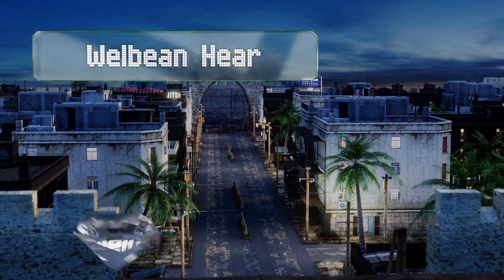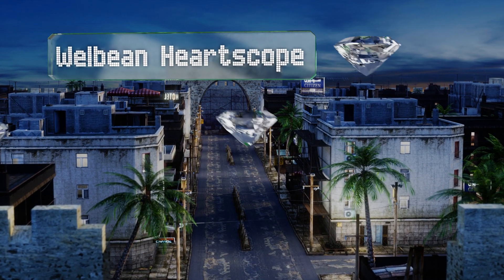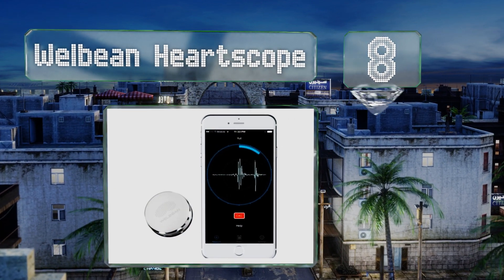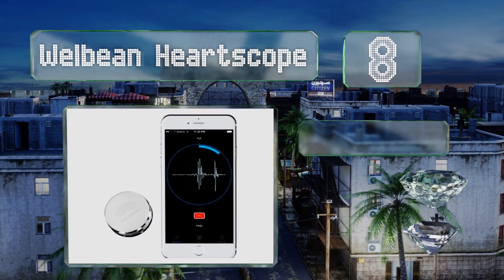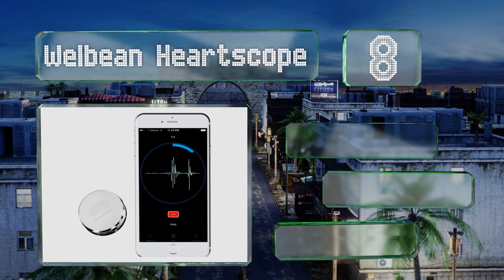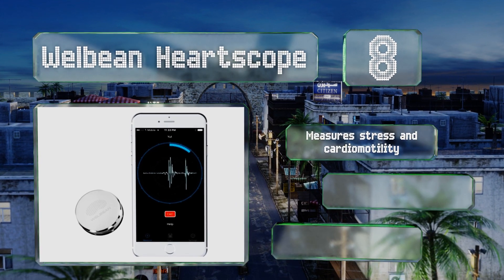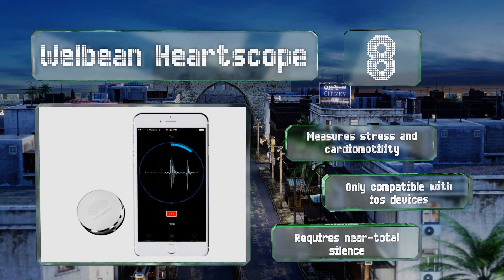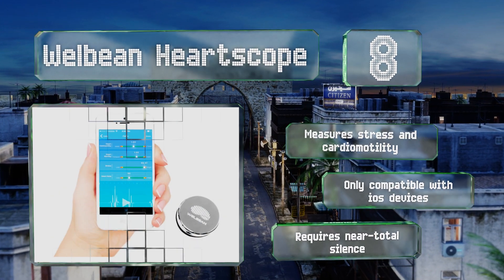Starting off our list at number eight, the Welbean Heartscope looks like a larger version of a stethoscope and functions in much the same way. Simply hold it to your chest and it will transmit all the relevant information directly to your phone, tablet, or other smart device. It measures stress and cardio motility; however, it's only iOS compatible and it requires near total silence.